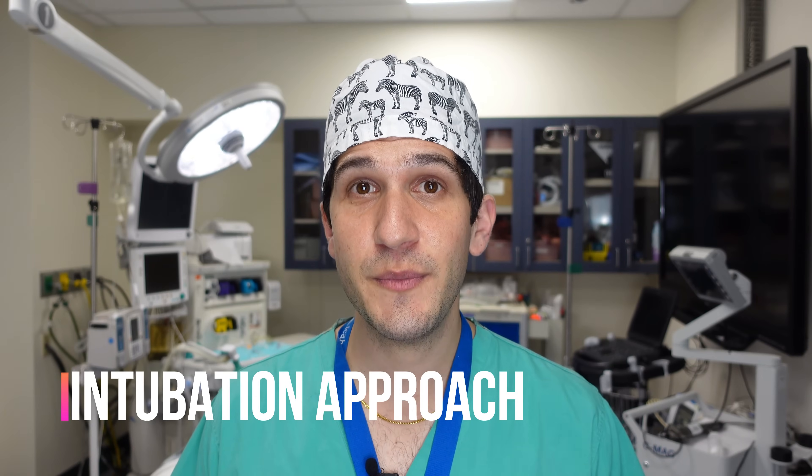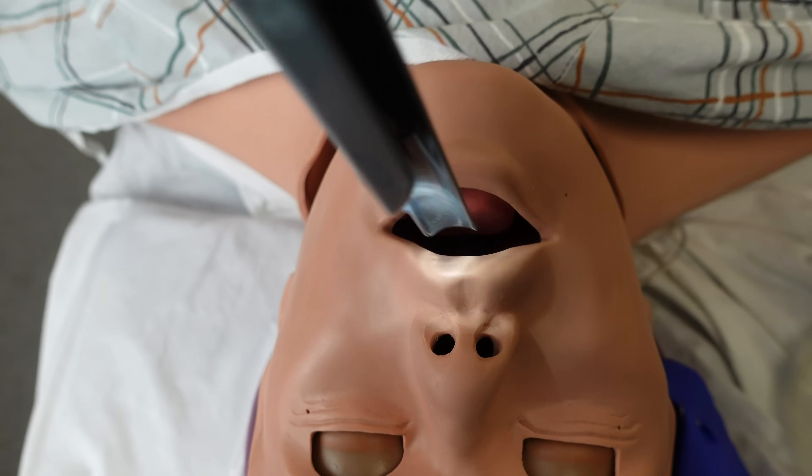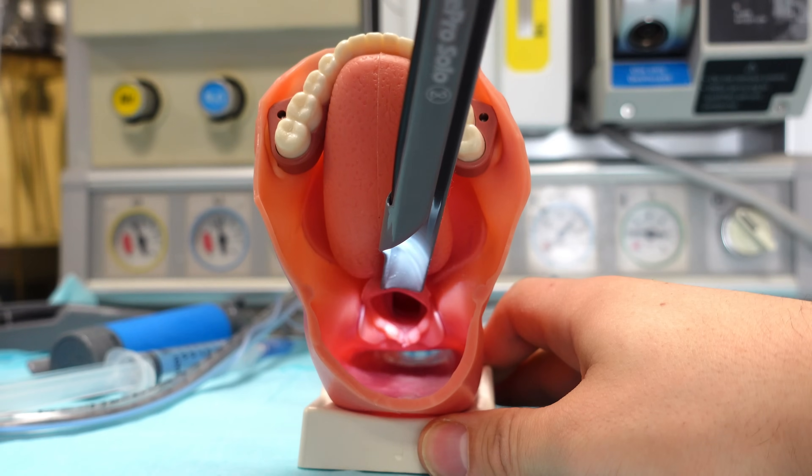Once patients are under general anesthesia they lose their lid reflex and their ability to protect their eyes, which can lead to corneal abrasion. For approaching intubation with a straight blade, I recommend coming in the right corner of the mouth and aiming the blade towards the midline of the patient — you're actually aiming at the epiglottis, because you want to physically pick up the epiglottis with the tip of your blade. As you advance the blade into the patient's mouth, you must be extremely careful not to press the blade against their teeth at all. If the back of the blade ends up pressing against someone's tooth, it can break — which is not only cosmetically a problem but then the tooth itself can become an airway obstruction before you have an endotracheal tube in place.